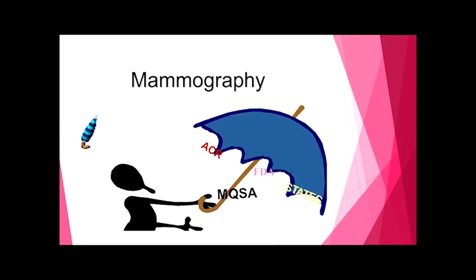So mammography has been an umbrella, and as I said, it's been a rocky road. It's been hard because it's been expensive. It's required changes in equipment and in technology and in clinical practice. So we've had to meet standards in a multitude of different areas. The ACR, the FDA, the states, MQSA.